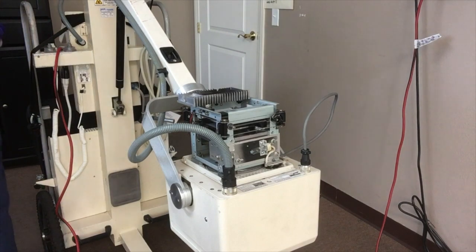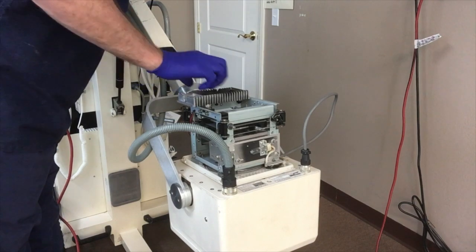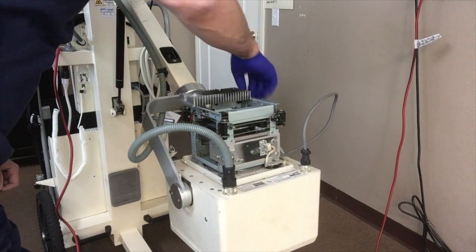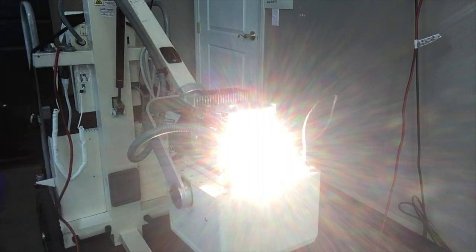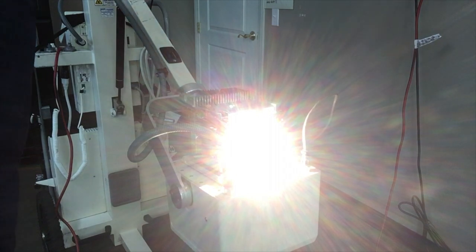Once you've replaced it, you do want to test it before you put everything back together. There, you can see it is working. The timer will turn it off after 30 seconds, and then you're ready to reassemble.